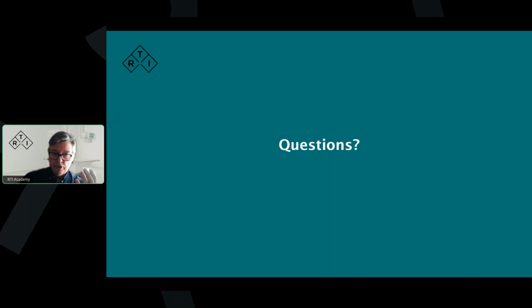If the radiation is lower than that, well, then we need to go to free run mode. We need to start the measurement, make the exposure, stop, and capture the data. Then we'll be able to get a good measurement reading. Then we pick everything up from 0 up.